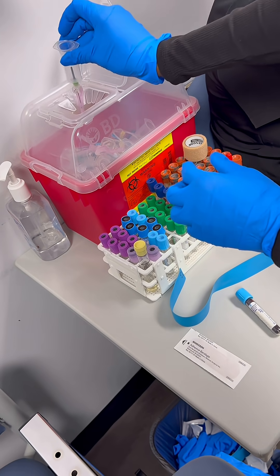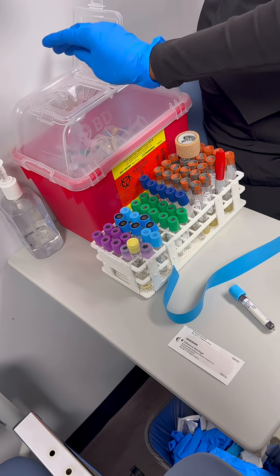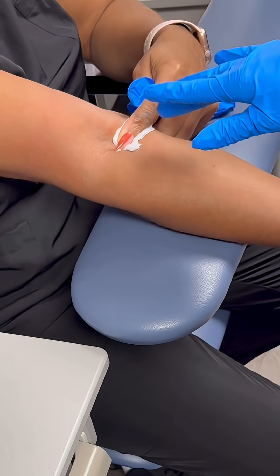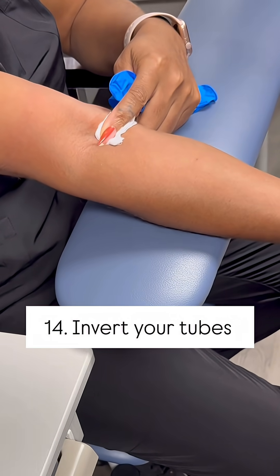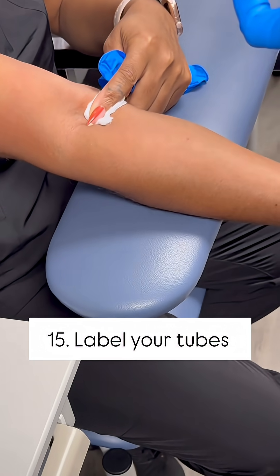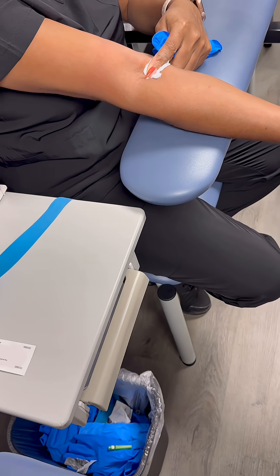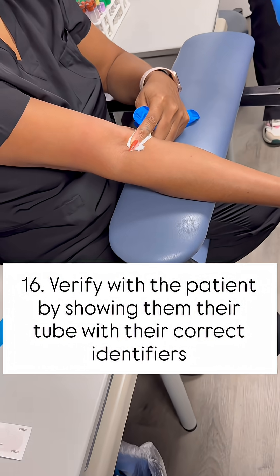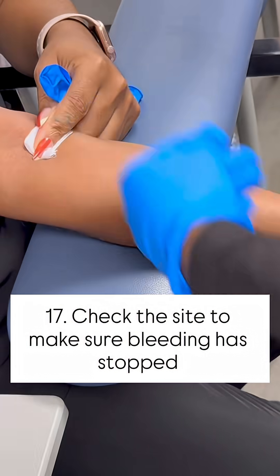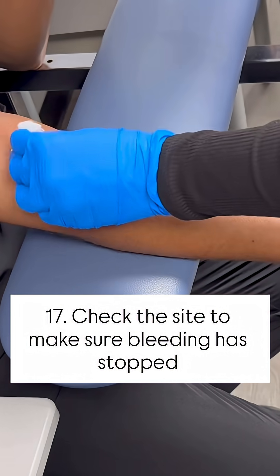Immediately put this in the sharps container — hub down — that way you're not accidentally sticking your finger inside. While she's applying pressure, this gives time for her blood to stop bleeding underneath that gauze. Now you're going to invert the tube, then get your marker. What's your name and date of birth again?